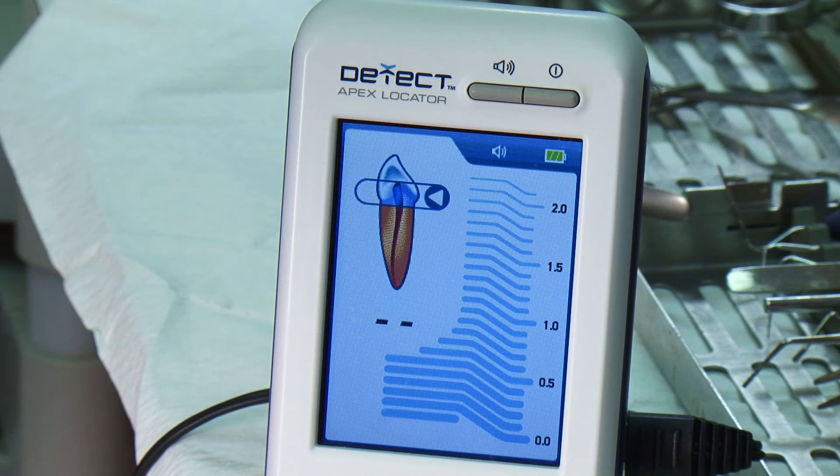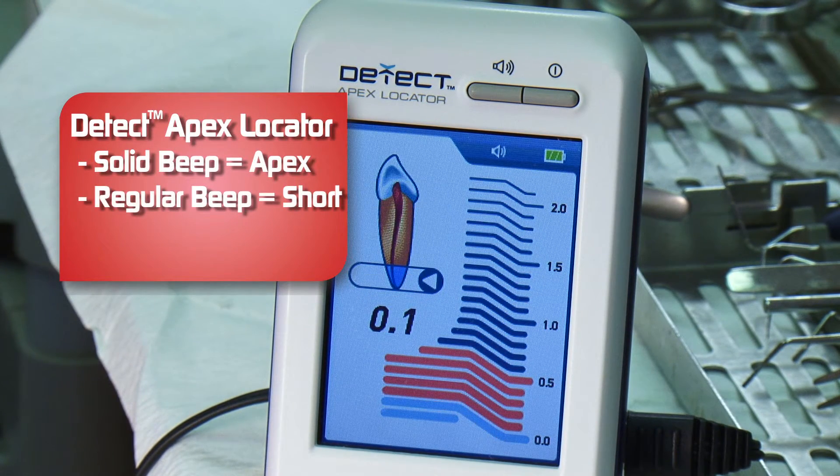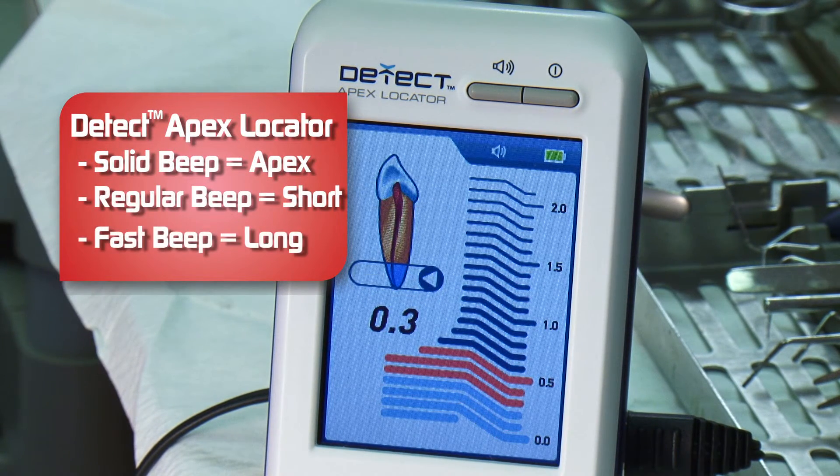I really like the screen. It is the most colorful, vibrant screen out there — it reminds me of my iPhone. Here you can see the red APEX light up on the screen. I slowly back off, and you can see the numbers. I like to be between the 0.5 and the 0.1 millimeter, and I'm right there.